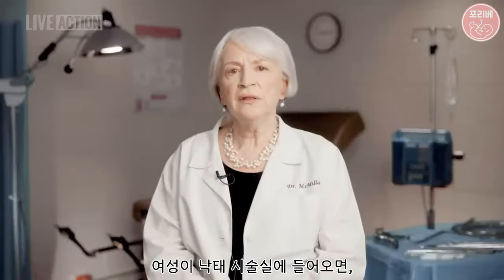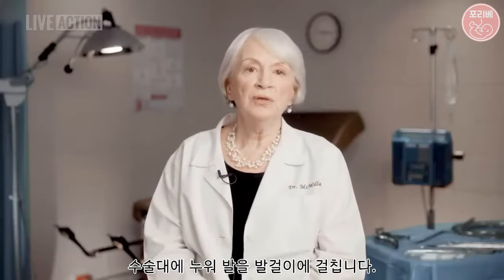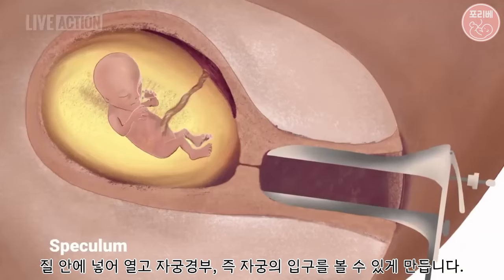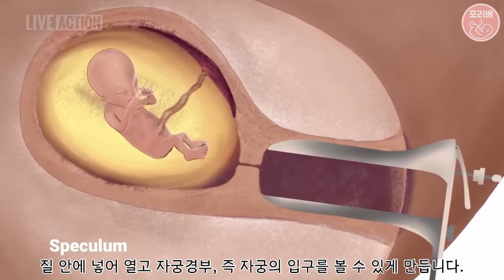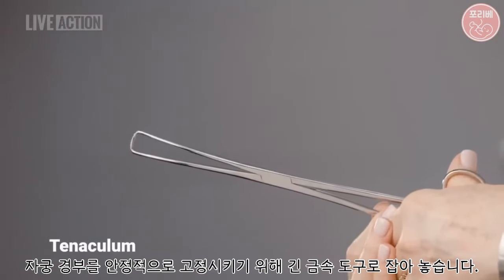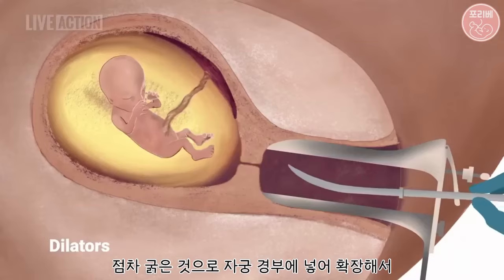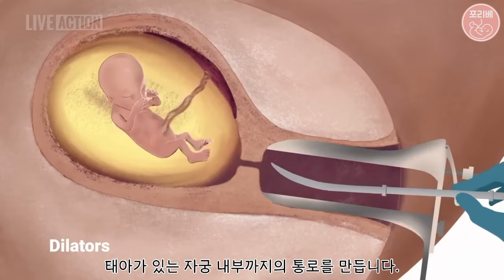When the woman goes to the facility for the abortion, she will lie on a table with her feet in stirrups, and she will be administered local anesthesia. The abortionist will place a speculum, like this, inside the vagina and open it, allowing the abortionist to see the cervix, the entrance to the uterus. The cervix is grasped with a long metal instrument to stabilize it. A series of metal rods called dilators, like these, which increase in thickness, are inserted into the cervix to dilate it, gaining access to the inside of the uterus where the fetus resides.